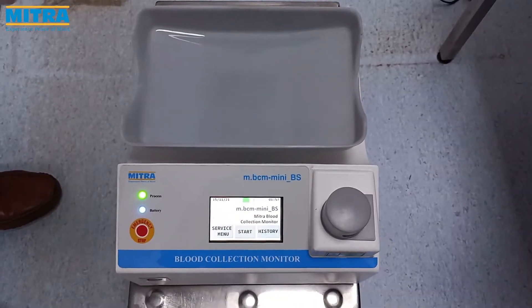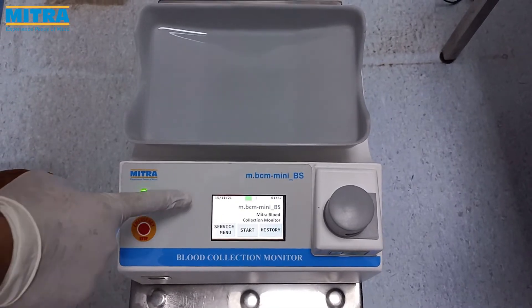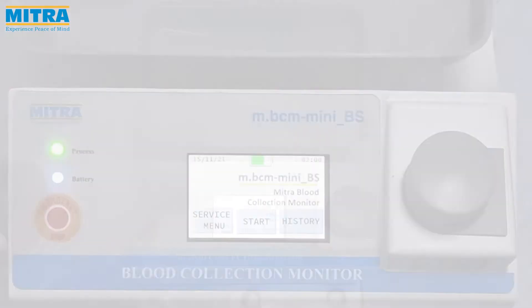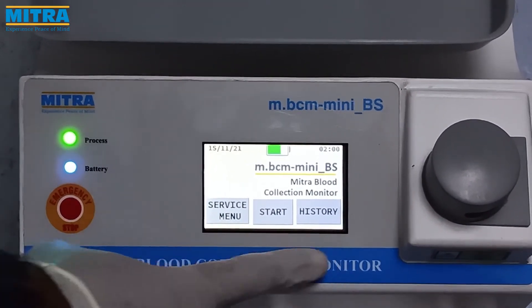This is the LED touch screen information display. It shows the battery status, time and date. There are three menus on the display: Service menu, Start, and History.